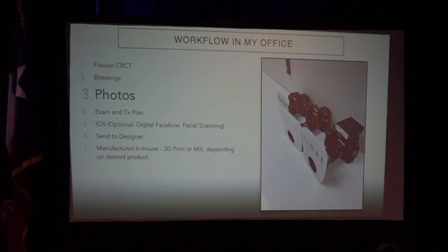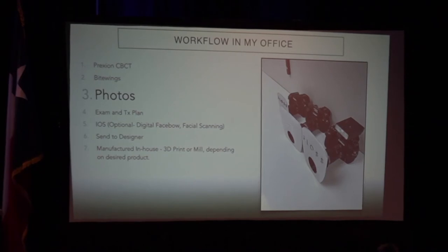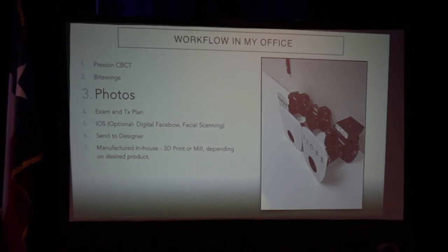Hornbrook was talking about sometimes the old school model. I had this problem too when I had my analog guy. Your model might be canted like that. The gingiva might be like that, and they just do it like this. They put the denture plate on there and then adjust it. But they don't know that your model might be canted. So photos are going to go along the digital design process. Very, very crucial.